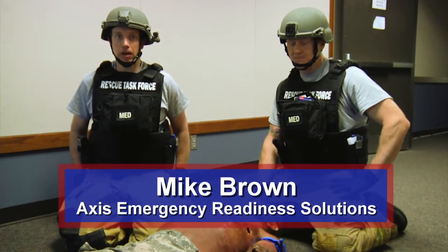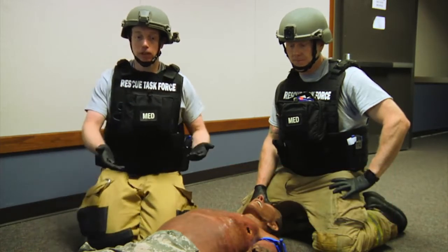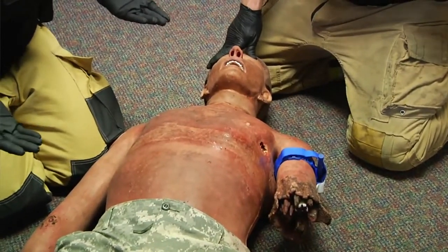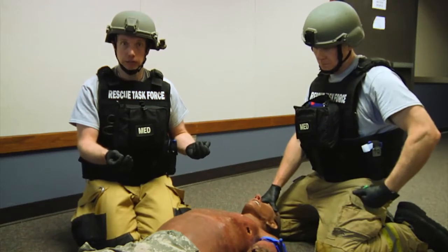Today we're going to talk about airway management within the Rescue Task Force concept. As you can see here, our patient had a couple of amputated limbs that we've treated with tourniquets. We're now going to address the airway.